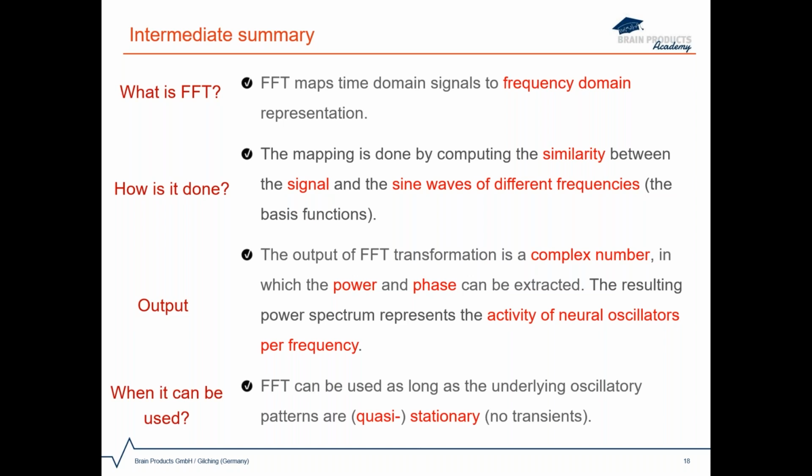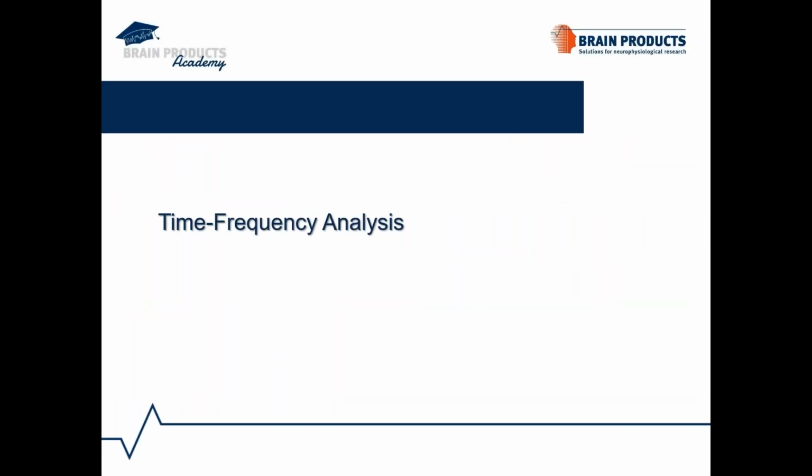It can be used as long as the underlying oscillatory patterns are quasi-stationary. An example would be performing spectral analysis of the alpha activity during an eyes closed, eyes open paradigm. Now we will dive into the time frequency analysis topic.